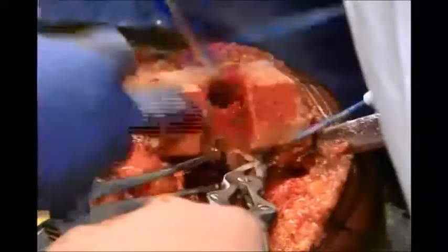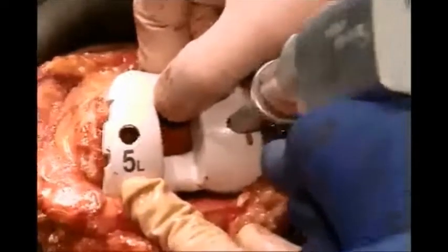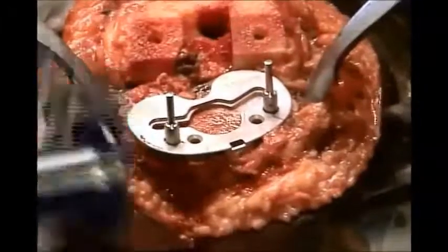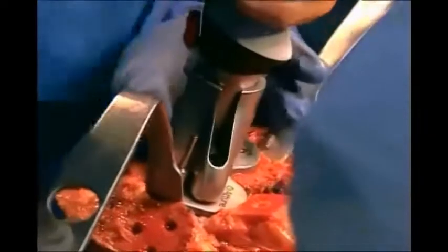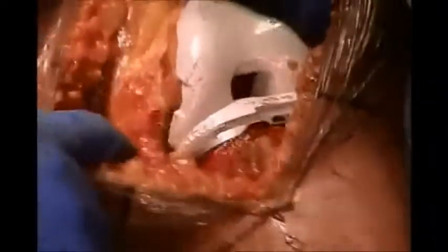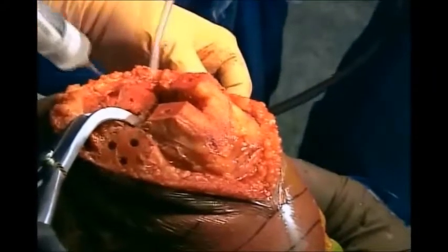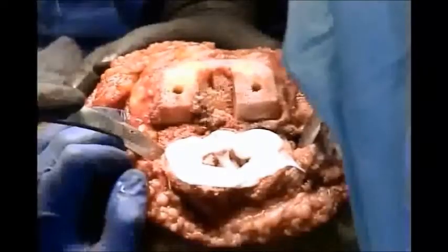I am removing the posterior osteophyte and to do that I apply a lamina spreader. Then I put a trial component. On the tibial side, you put the appropriate size tibia and mesh it to the cortex of the cut surface. After you put the trial component, you test for stability in extension — it should open 2 to 3 millimeters on both sides. If it doesn't open equally on both sides, you have not released it properly.